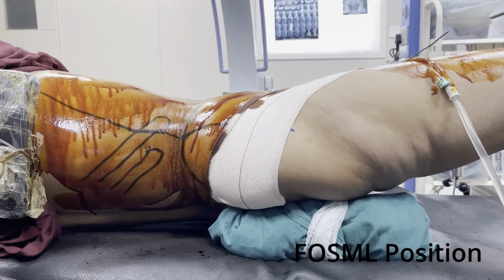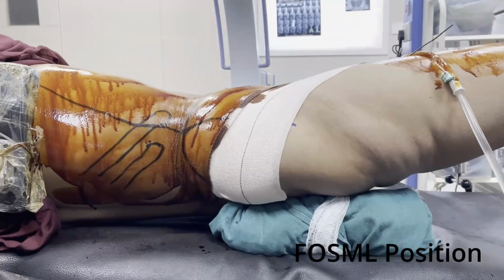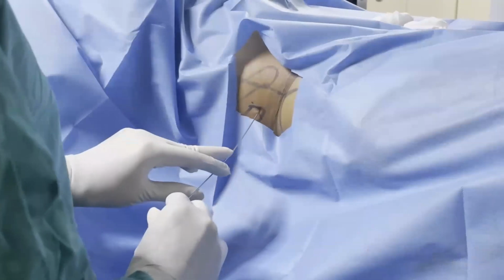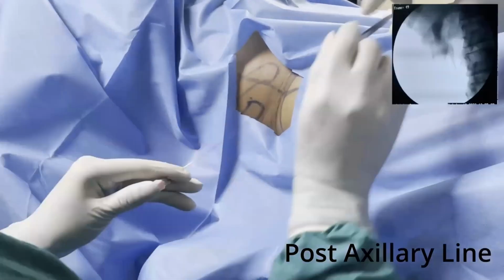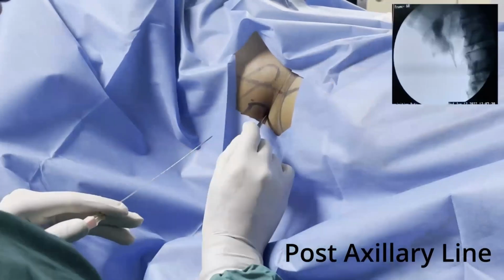After painting and draping, the patient is placed in this position. And then first of all, we puncture the kidney after doing a pyelogram. We select the calyces to be punctured. Usually the posterior calyx is punctured. When we do the pyelogram, the contrast by gravity settles down into the posterior calyces. So we target those calyces which are dark.